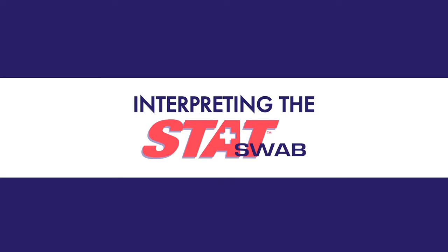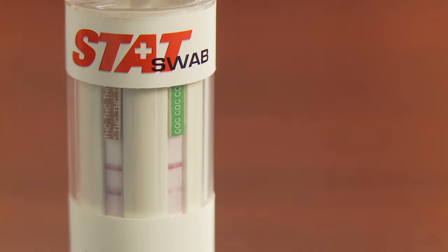Interpreting the StatSwab. To interpret the results of the test, look at the test result window. There will be a control region along the top of each strip and a test region along the bottom of each strip. Interpret the presence or absence of the line in each region. One red line should appear in each control region under the corresponding drug abbreviation. This is an indication that the test has run properly.